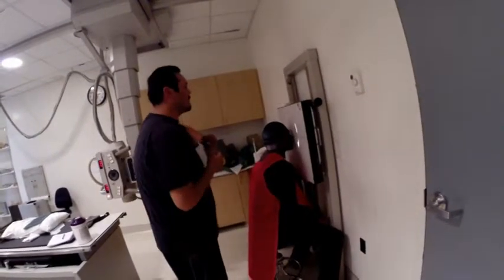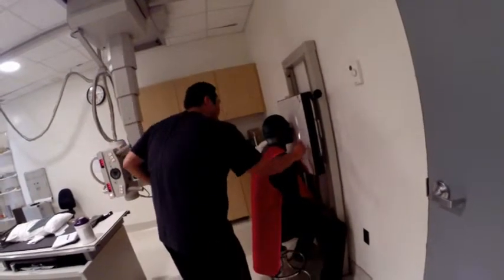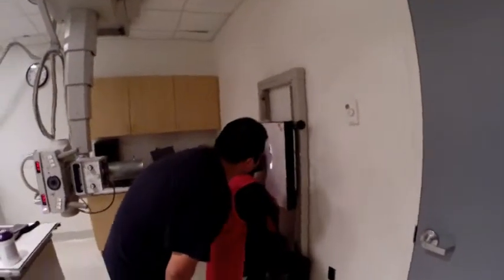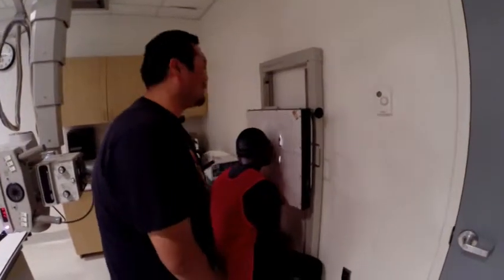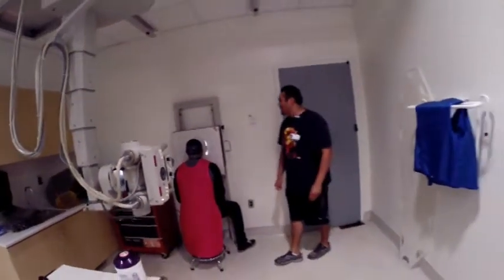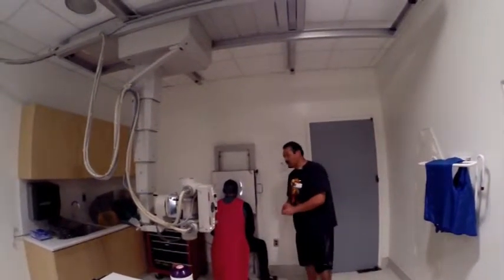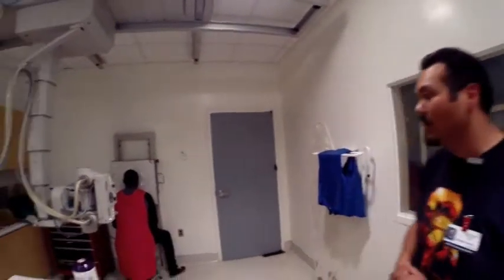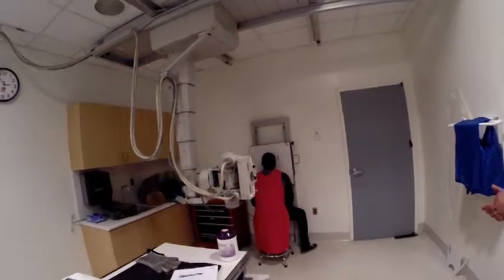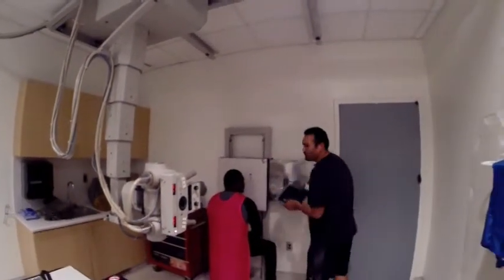We line up our tube with the bucky and cone down to the area of interest. We put our marker on — right side, right here. The center ray is exiting at the acanthion. Our technique is going to be roughly 75 at 8 for Mr. Hutchinson. Let's head this way — be safe and out of the beam, sir. Go ahead and hold your breath. Expose. Go ahead and relax. We're going to switch our film out. That was our first shot, PA.